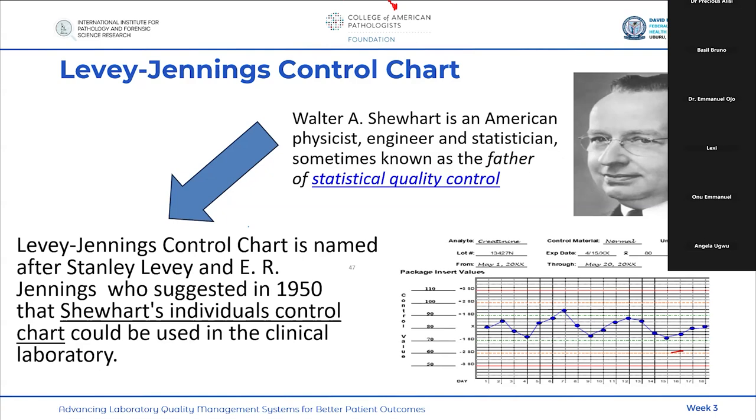And to also mention that there are now automated systems. Even simple Excel has been optimized that once you put in your QC limits, the mean, the SD plus 1 SD, plus 2 SD, minus 1 SD, minus 2 SD limit, once you enter the data, it will plot the graph for you.